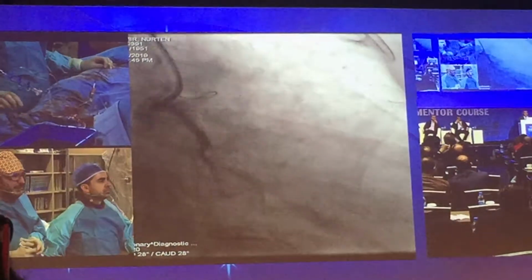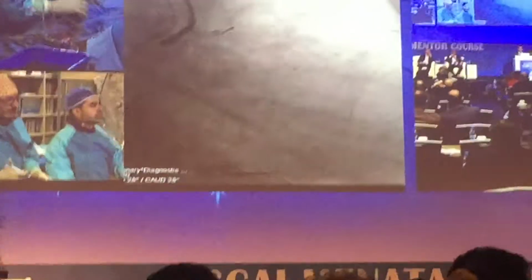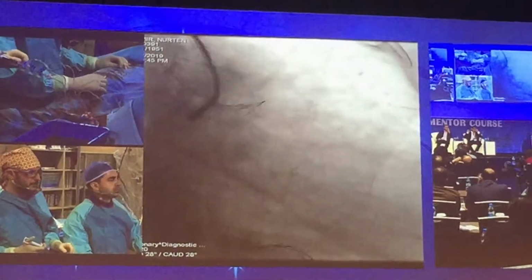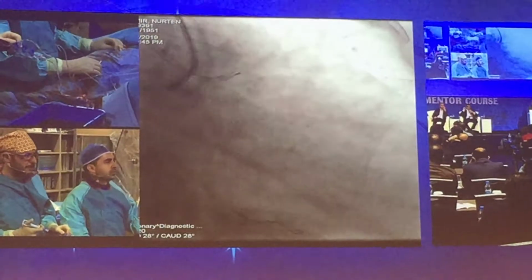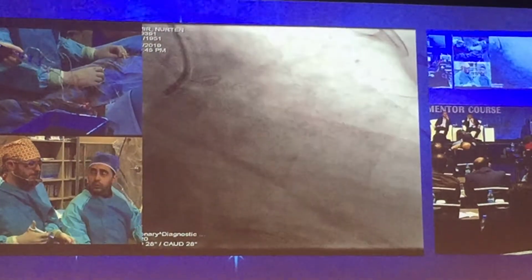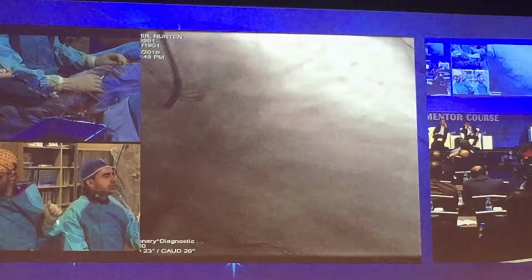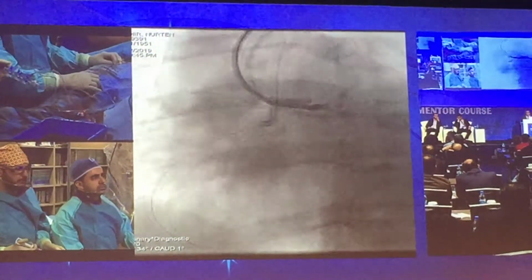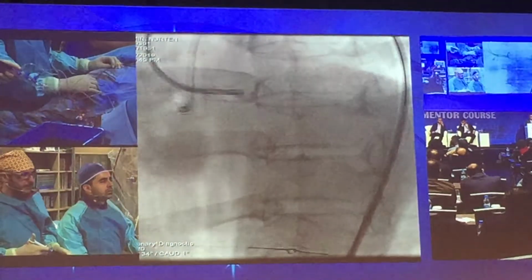The engagement of the catheter is not so good. I think it is not truly aligned parallel to the coronary artery, the left main, and it may cause a dissection. Left oblique. Okay, these are the shapes. The left main is large enough.